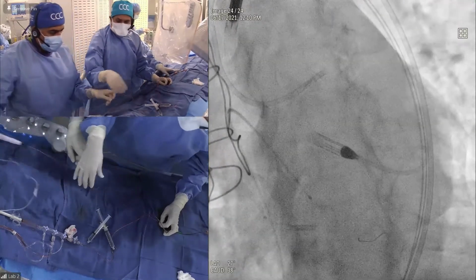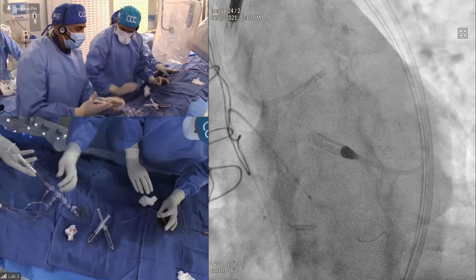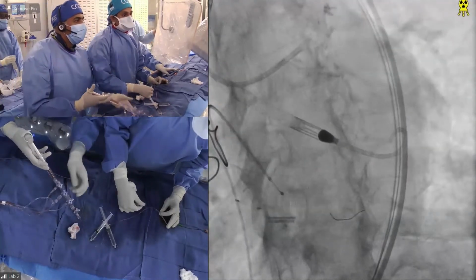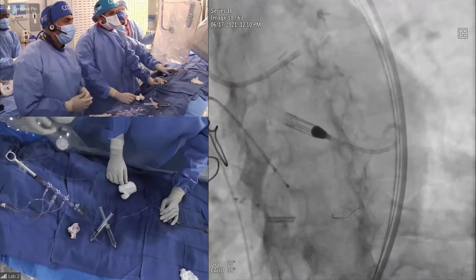Okay. I've got to say that I don't really like the 1.25 burr. If you take a look at the angle, it's a very shallow angle. The 1.5 has a steeper angle, kind of like the LPL. It actually cuts better. I think the 1.25 doesn't really cut very well. Now use 1.5.